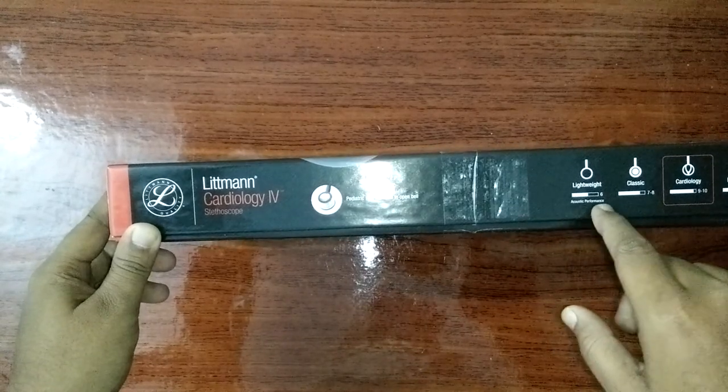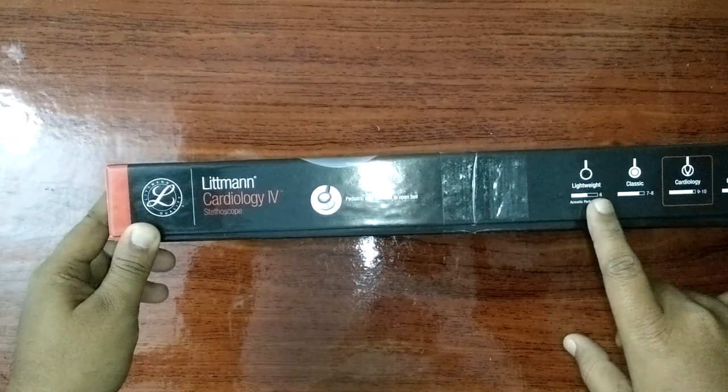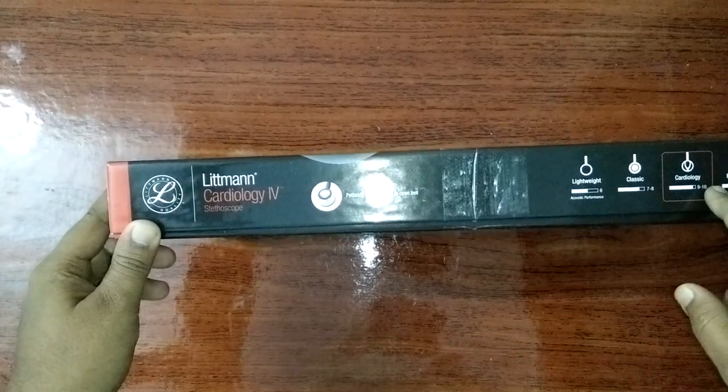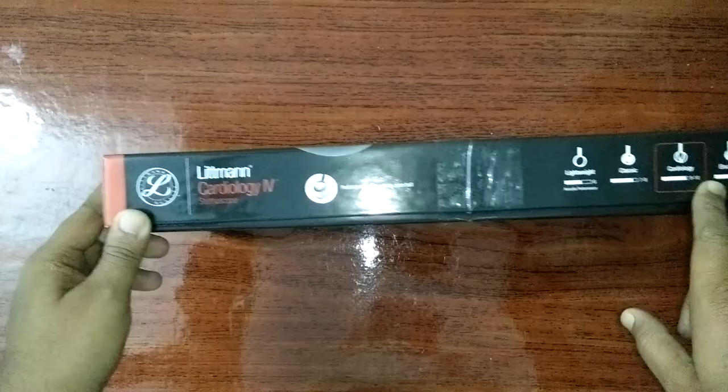Acoustic performance — rated 6 for lightweight, Classic 7, 8, and Cardiology 9 to 10. Electronic 10 Plus.